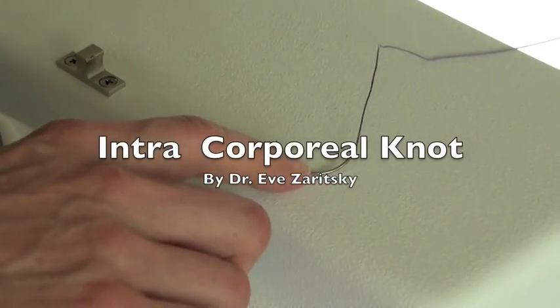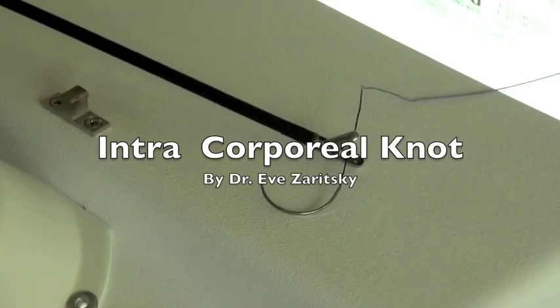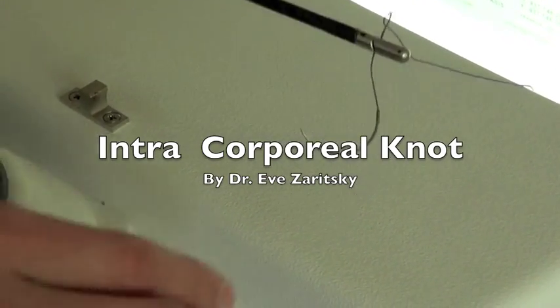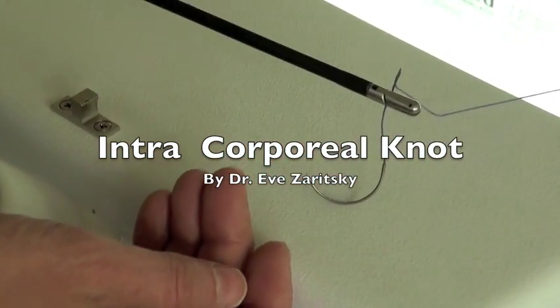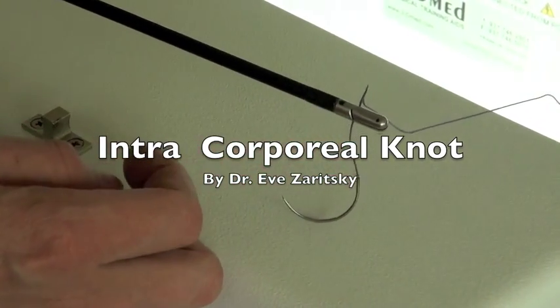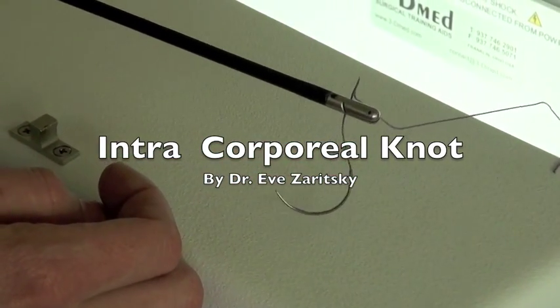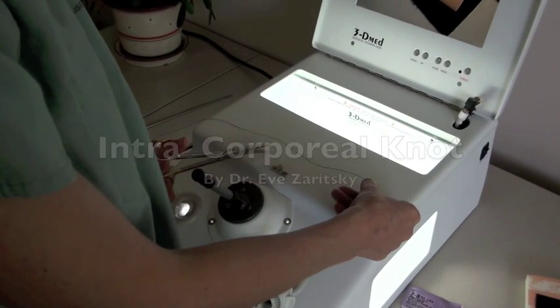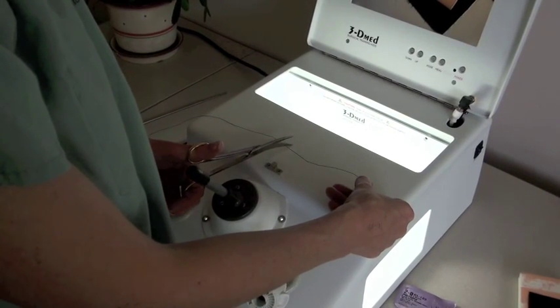I want my needle to be facing to the left. I'm going to grab it with my left hand to load it to myself. Notice how I have about a centimeter between the needle hub and my instrument. I'm going to cut this about 7 inches.